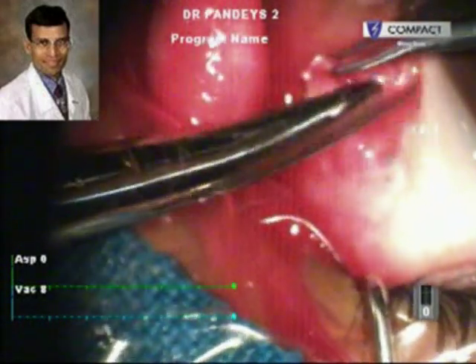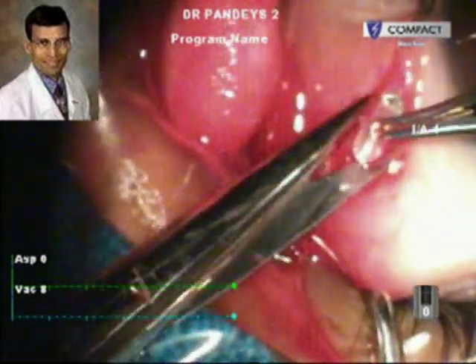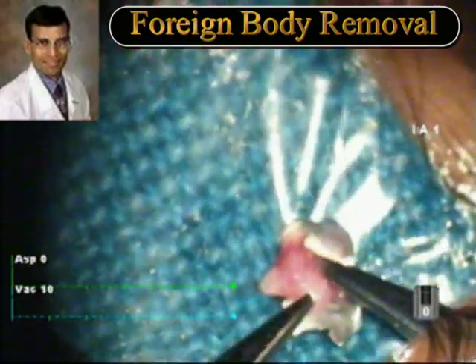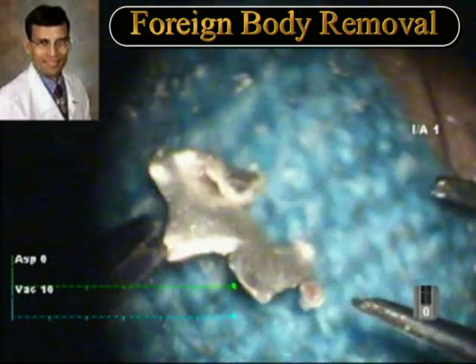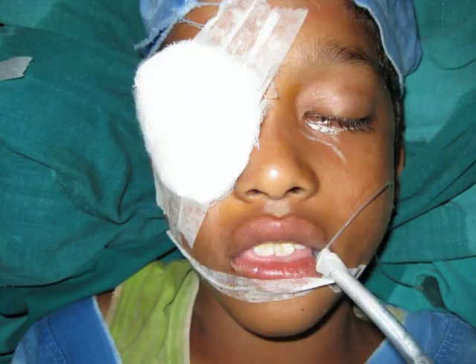In these cases it is very important to do good imaging studies — an X-ray and an ultrasound — before performing the surgery, so as to rule out any foreign body and to rule out any problems in the posterior segment like retinal detachment or a separately retained intraocular foreign body. This must be done before surgery so that we can ensure good management, and also for medico-legal purposes these documentations are extremely important. The foreign body has been removed. This case was done under general anesthesia, and at the first post-operative day there was hardly any inflammation in the anterior chamber. The eye was quiet and the child achieved a vision of 6/9 unaided, and the child as well as his parents were very happy.